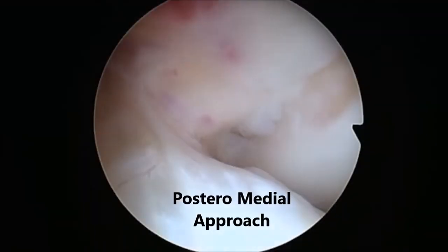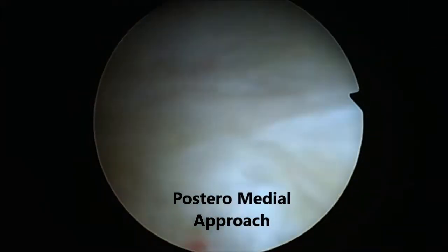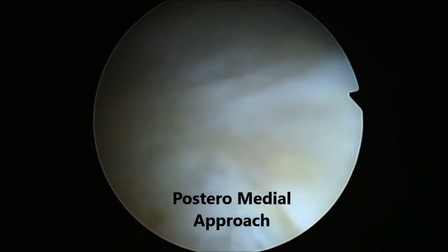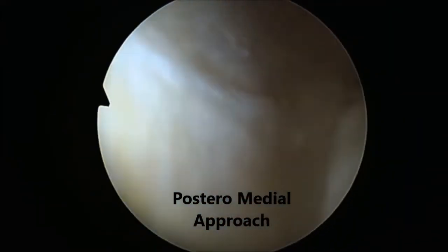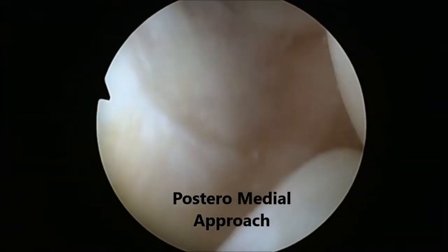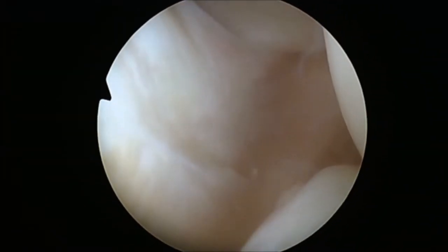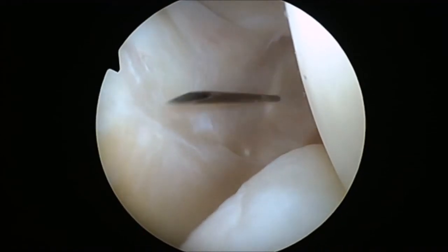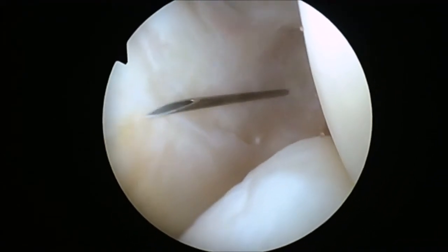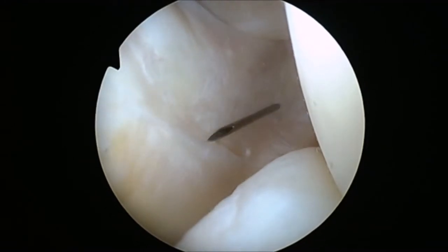For the posteromedial approach, the camera should be pushed trans-notched to the posterior compartment. Using transillumination, a needle is introduced in the posteromedial aspect of the knee, followed by a number 11 scalpel creating the portal. A cannula is not necessary.